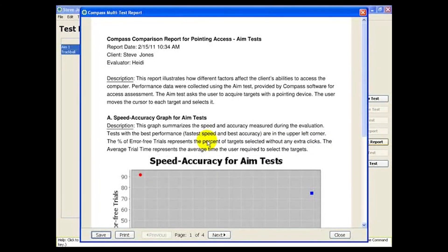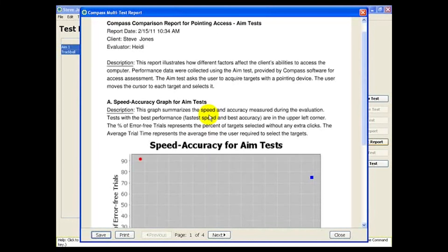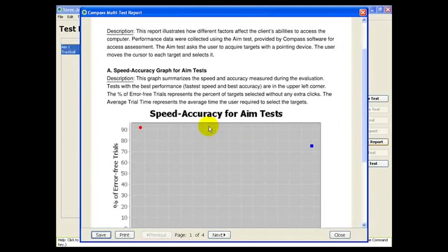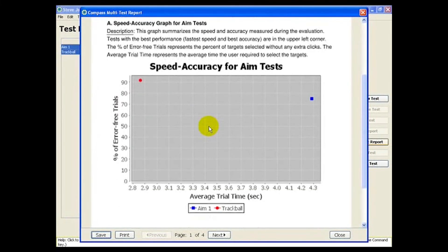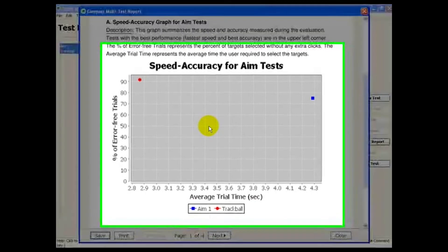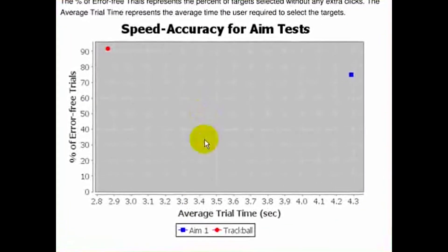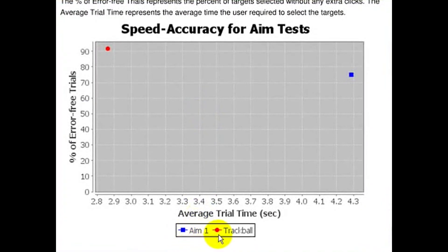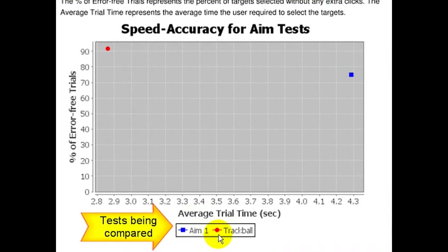This report has four pages. This first page has a summary profile showing both speed and accuracy for the two AIM tests. Each test is represented by a single point on the graph.